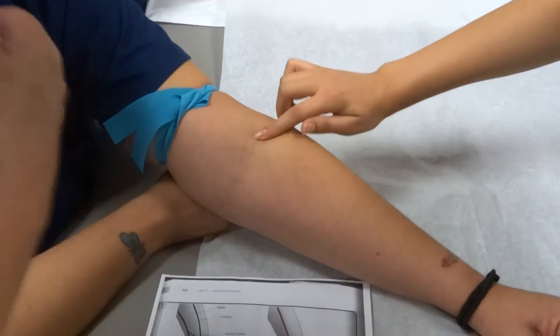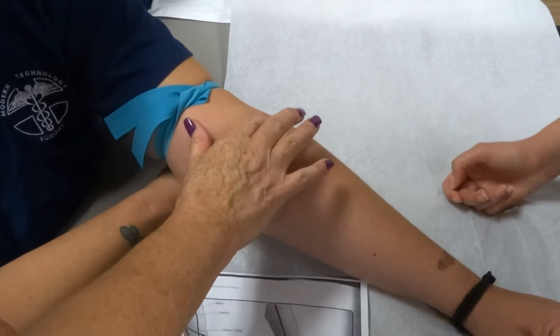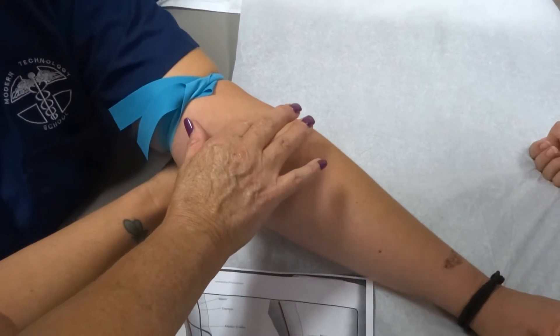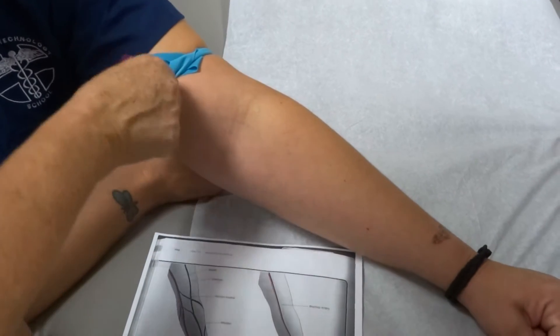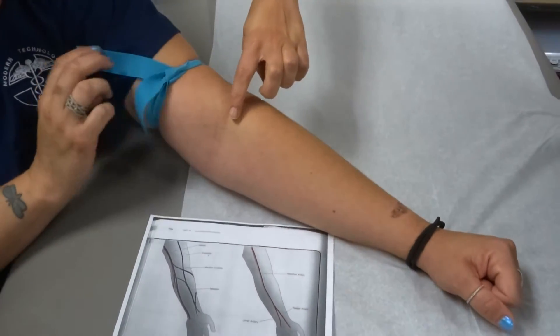Another technique is you can take the alcohol and the cotton swab and just kind of massage it and it'll come up to the surface. What about warm? They retreated. They're deep. They're really deep. Let's see what her other arm looks like. They retreated, they're hiding.